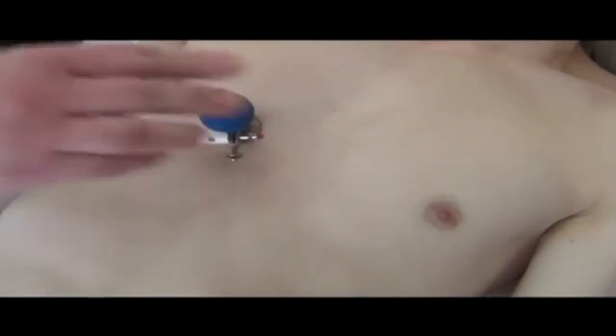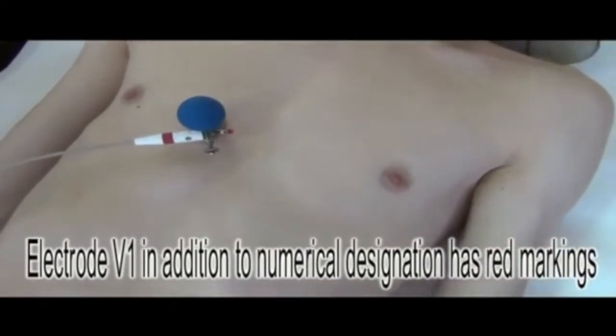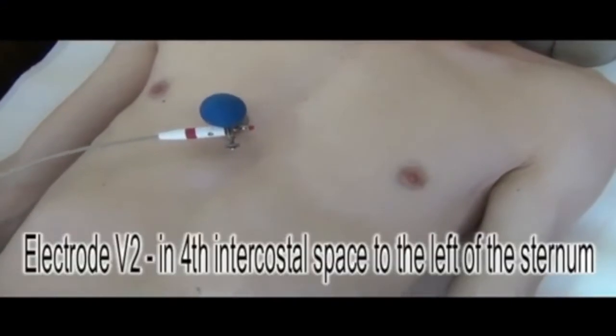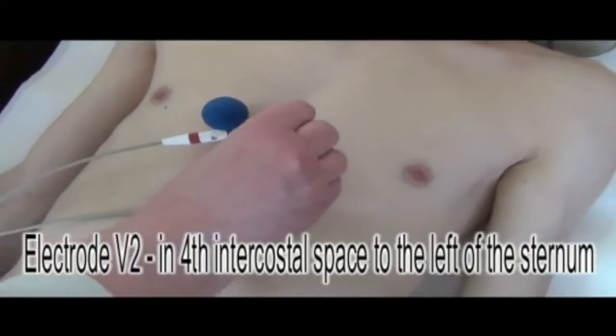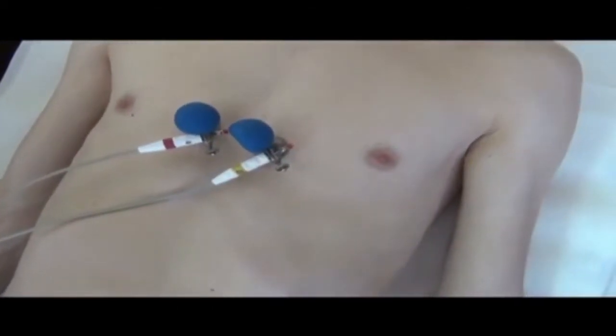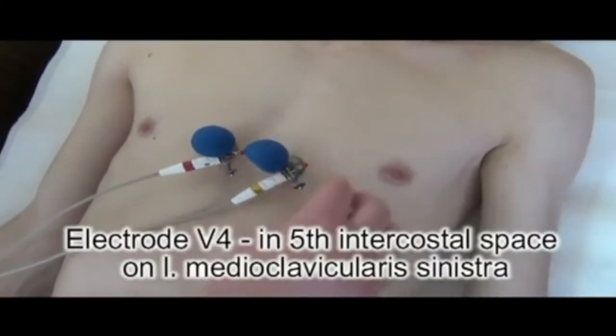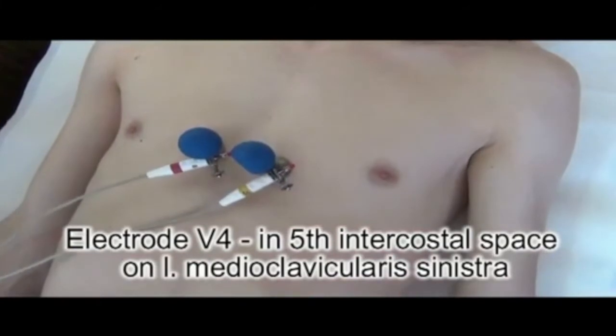Fix electrode V1, which as usual has red color. Electrode V2 should be placed at the 4th intercostal space to the left of the sternum. After this, we should fix electrode V4 at the 5th intercostal space on the left midclavicular line (linea mediaclavicularis sinistra).